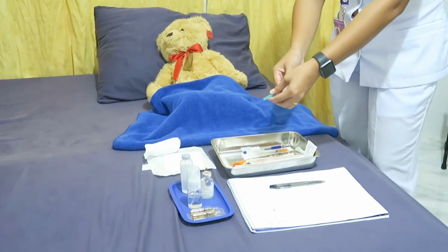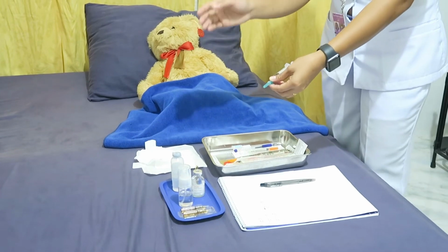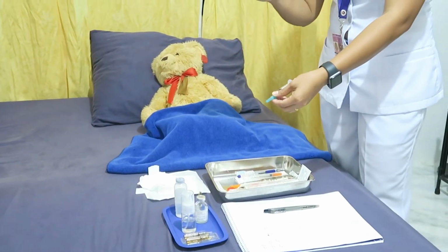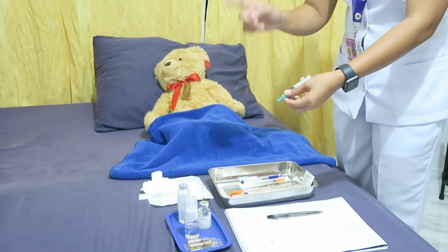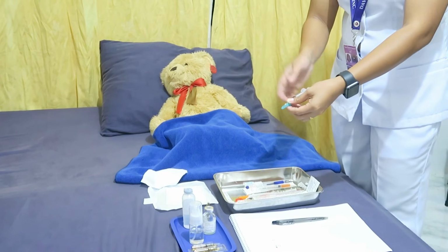And then, after attaching the filter needle, remove the cap from the filter needle and insert the needle into the center of the ampule. Then, do not touch the rim of the ampule with the needle tip or shaft.